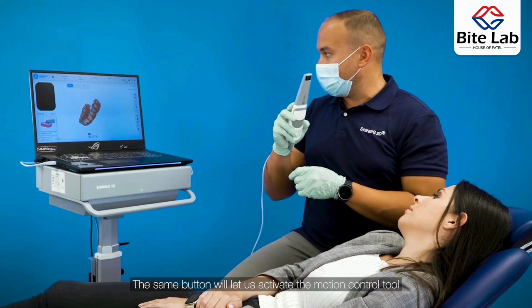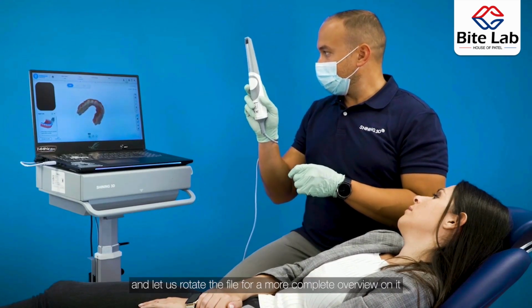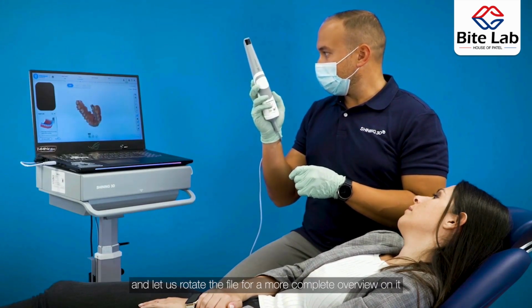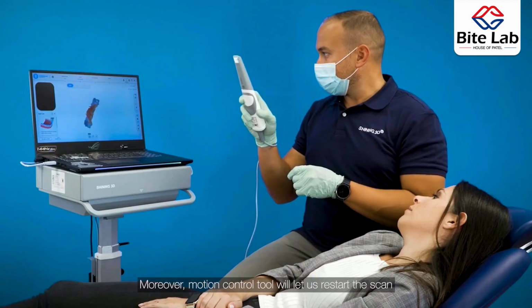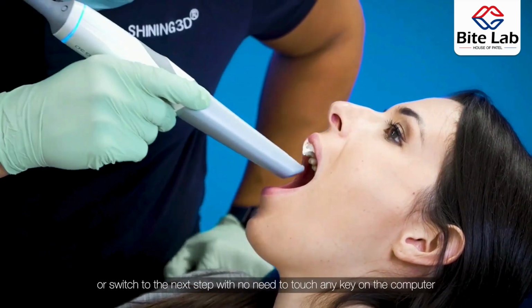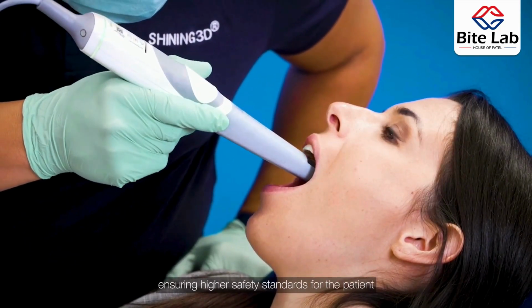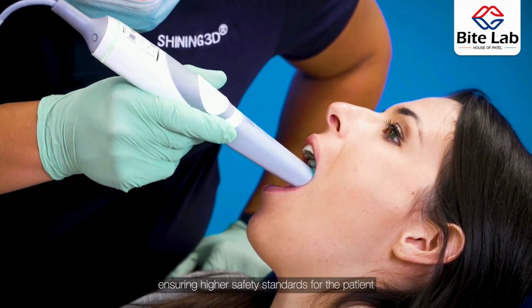The same button will let us activate the motion control tool, as you can see now, and let us rotate the file for a more complete overview on it. Moreover, motion control tool will let us restart the scan or switch to the next step with no need to touch any key on the computer, ensuring higher safety standards for the patient.